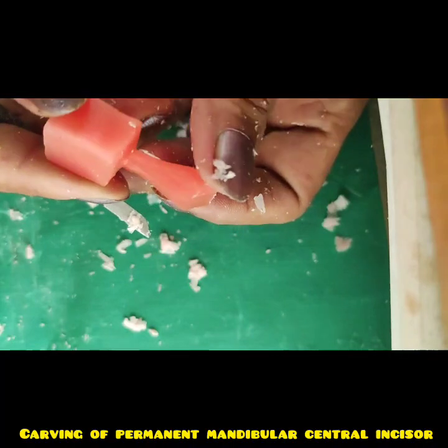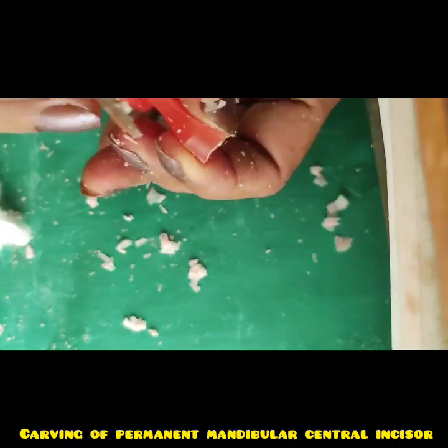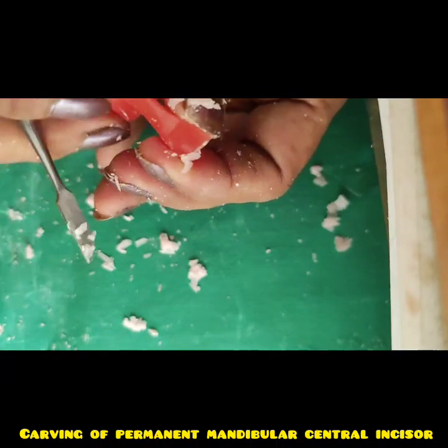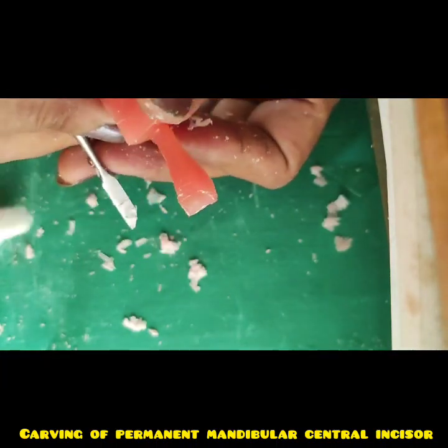Okay, now you can see my labial surface has become too sharp at the bend, at the inclination. So make it smooth, it should not be sharp. And this is how our labial surface is done.